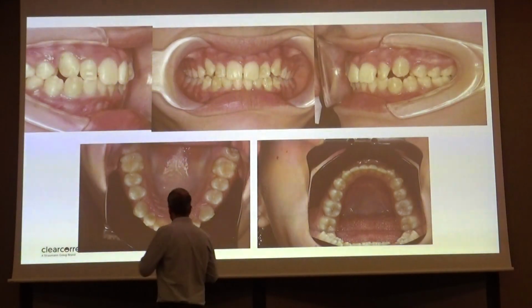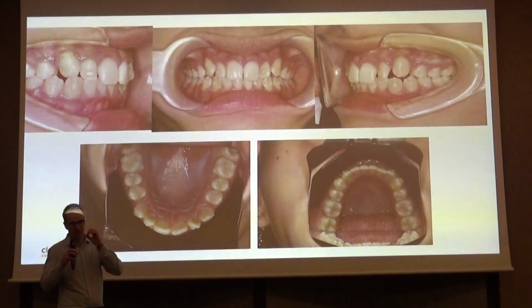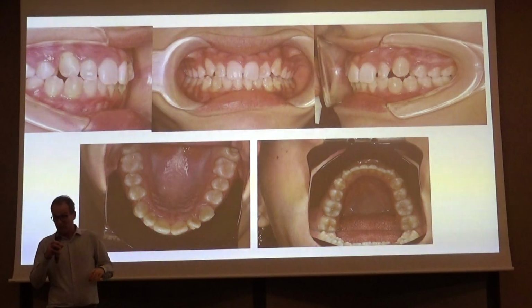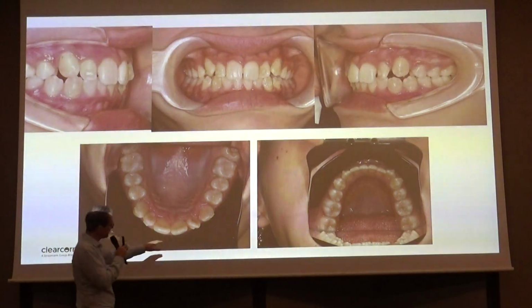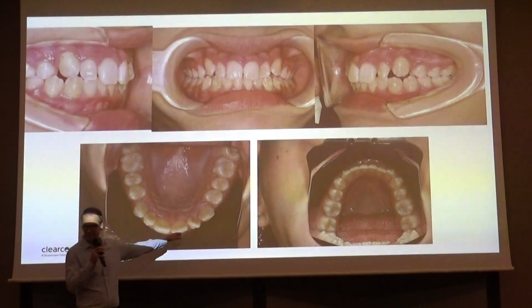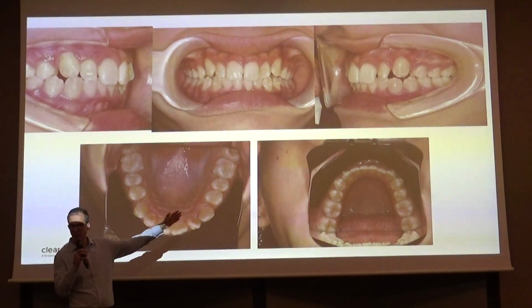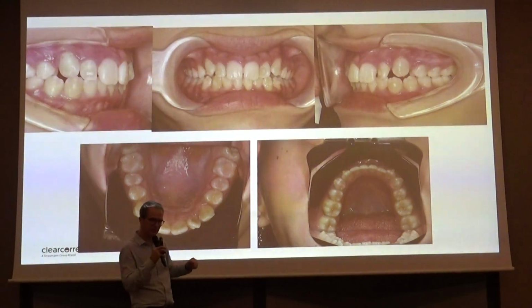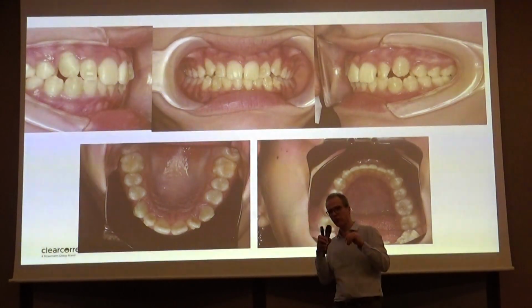that I approved this case like this. It was running very well, very well. But in the daily practice, this patient, what she wants is to rotate this lateral. So she is under treatment for 6 months, and she is with the lateral rotated. Right, so this is bad. This is bad from the clinical point of view.